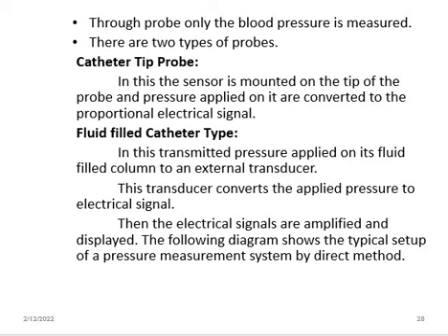That change in the fluid column is converted into an electrical signal using transducers, and that electrical signal is amplified and displayed in the system.